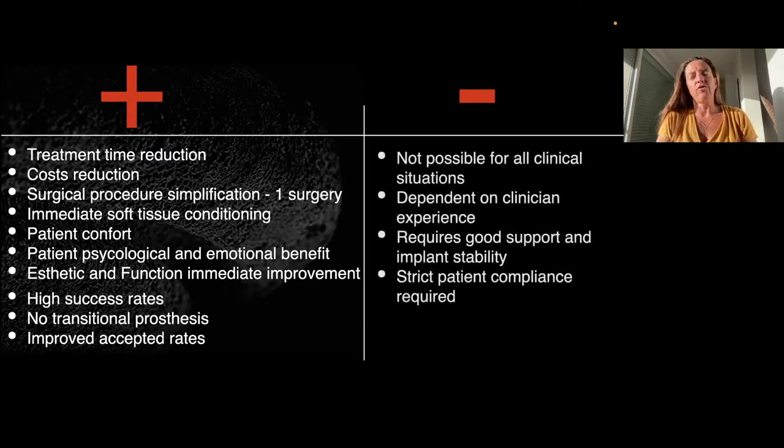In terms of disadvantages, unfortunately, it's not possible for all clinical situations. Sometimes you have big infections, which you then have to compensate somehow, and you want everything to heal without immediate load. Sometimes the bone is very soft, but it also depends on clinical experience, on the learning curve. It always requires good implant stability, and of course it's also demanding because you have to have strict patient compliance, and this is a big requirement so that you can control all the healing phases of your patient.